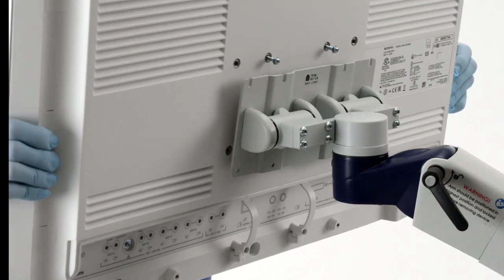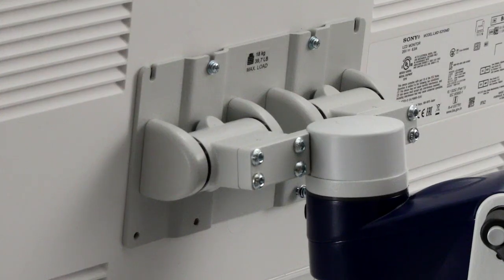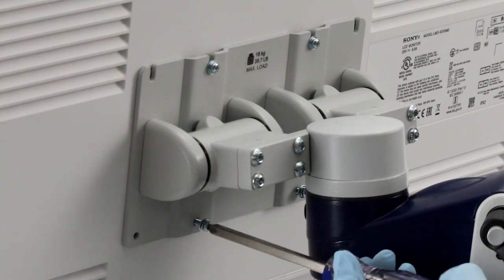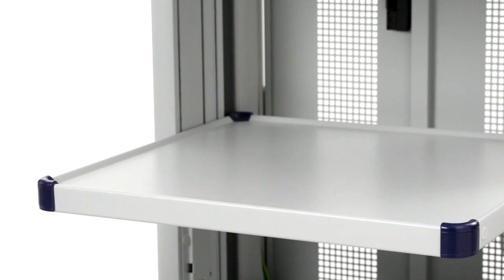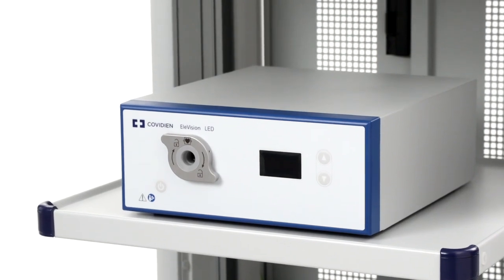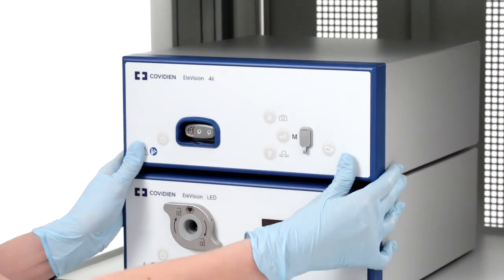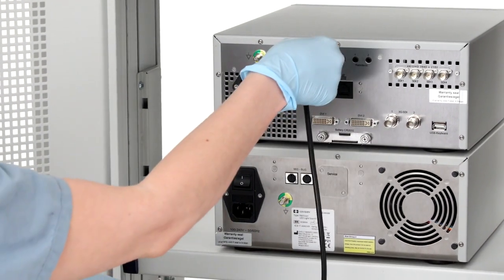First, you'll need to mount the monitor to the cart. Keep in mind you'll want to make sure you have adequate space around the unit for ventilation and servicing. Recommended measurements can be found in the instructions for use. Place the light source on the cart. Once this is complete, add the CCU to the cart, making sure that the ventilation slots are not obstructed and the main power switch on the rear of the device is accessible. You can then connect the light source to your CCU using the MIS bus cable.